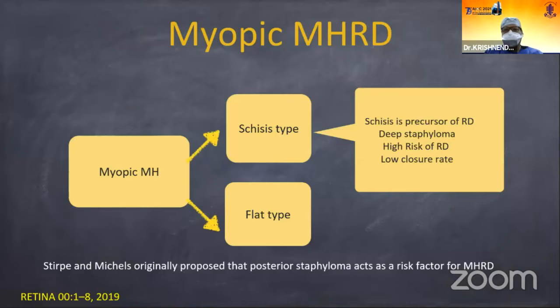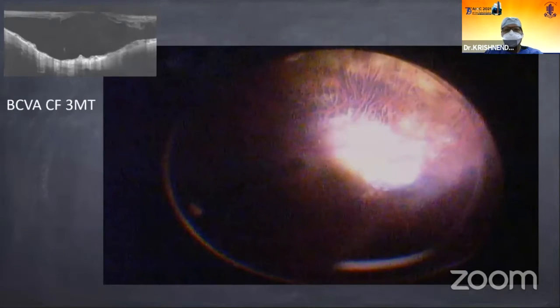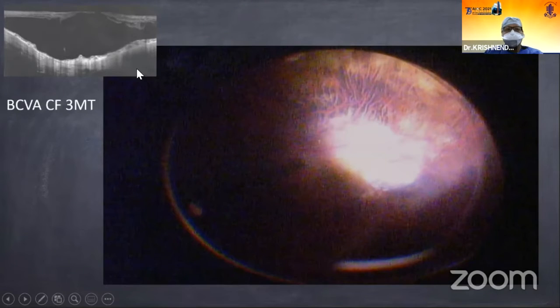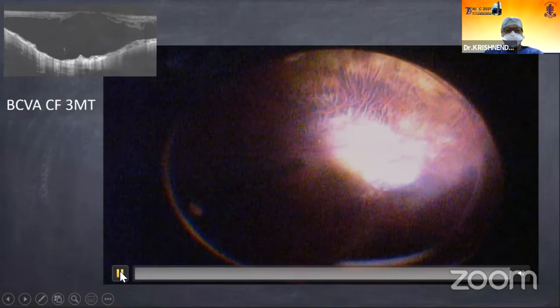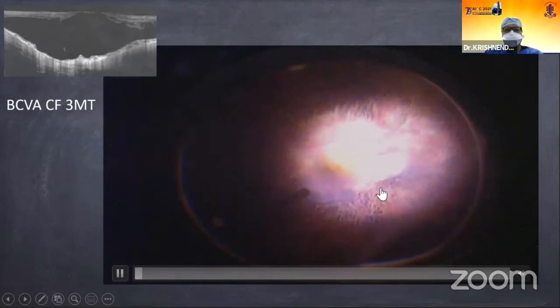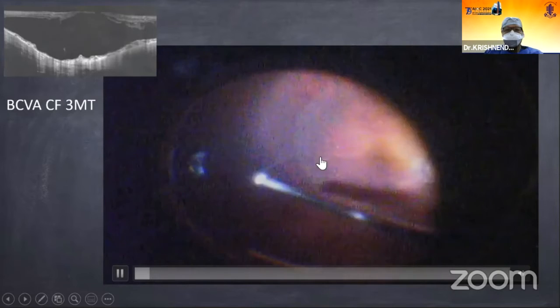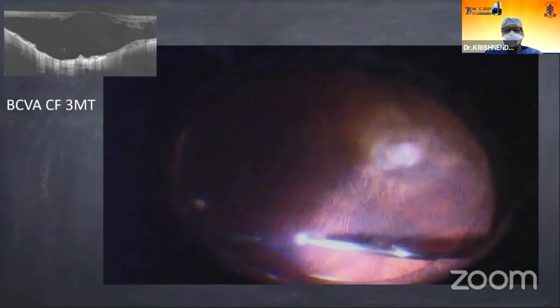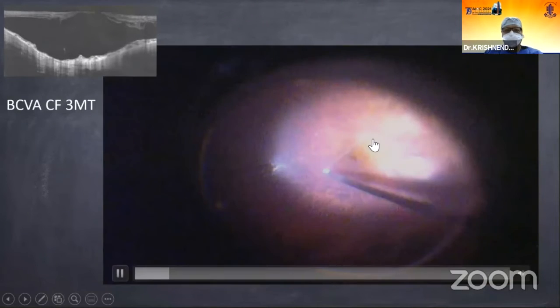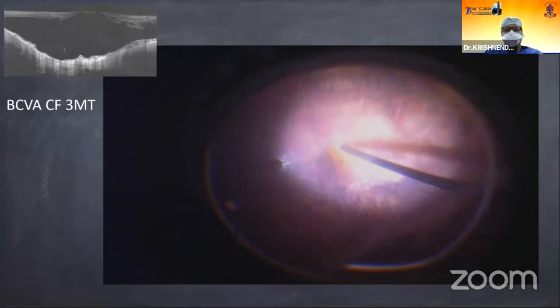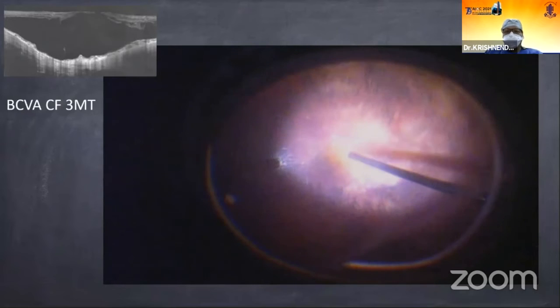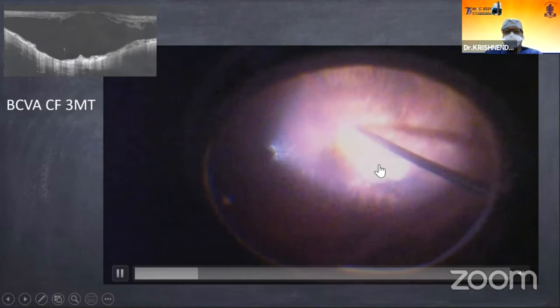Moving on to myopic macular hole retinal detachment — schisis often leads to progression of retinal detachment in myopic patients. This is an example of a 45-year-old male with a myopic macular hole with large foveal detachment. You can see an area of foveal detachment at the center with myopic degeneration. We started with vitrectomy. Since myopic patients often don't have posterior vitreous detachment, we stain the posterior vitreous with triamcinolone and use a silicone-tipped flute needle to make a cleavage in the posterior hyaloid to induce PVD, with multiple strokes all around away from the foveal area.